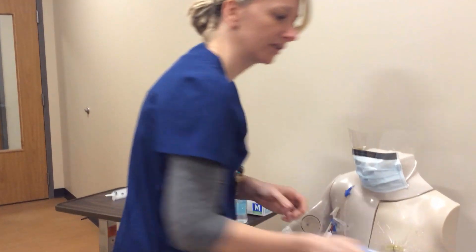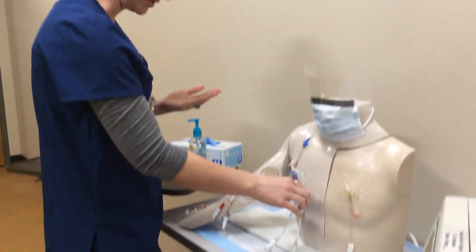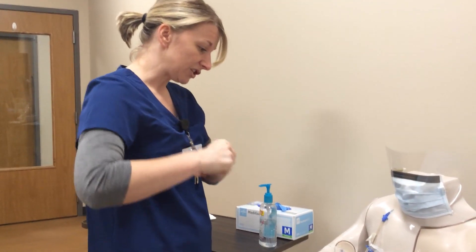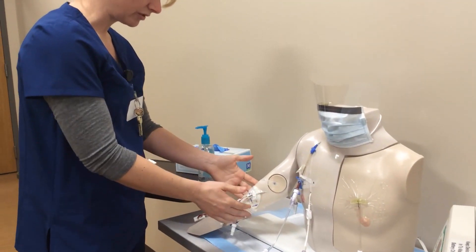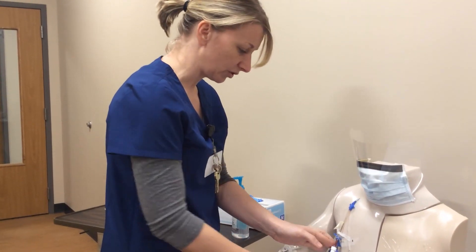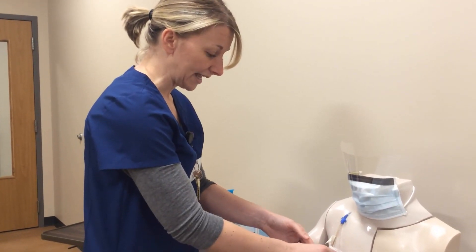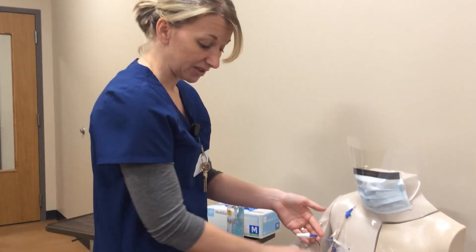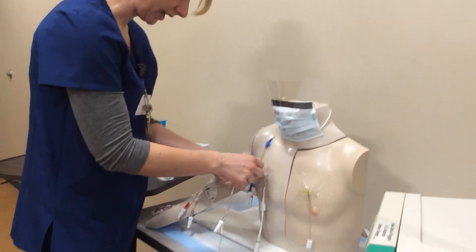Let me change my gloves. He's got something going in this line and we're not going to draw from this port — instead I'll draw from one of the other ports. This one has been heparin locked. I introduce myself, double-identify the patient — he gives his name and date of birth. Dan, since you have this line running over here, I'm just going to use one of your other ports. Whenever somebody has more than one line, all other lines must be clamped when drawing from one particular port. I'll put my IV on hold and clamp this tubing.